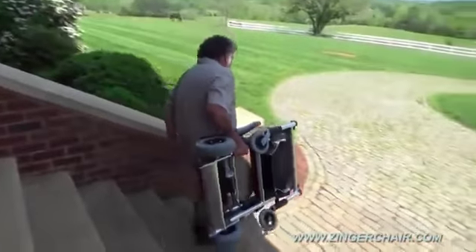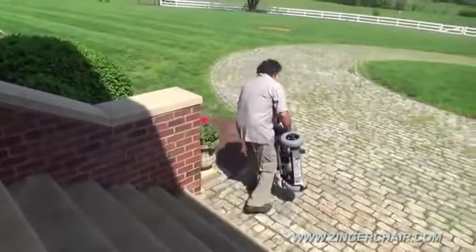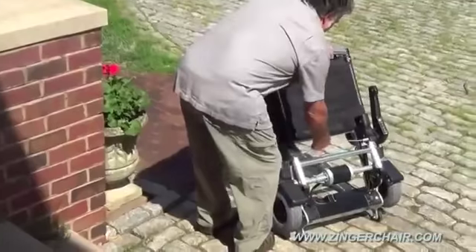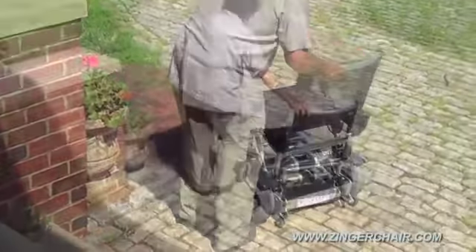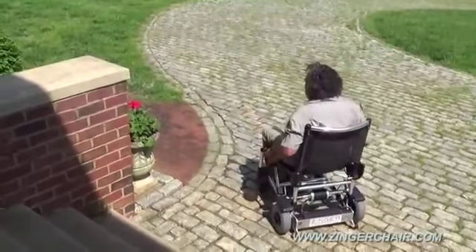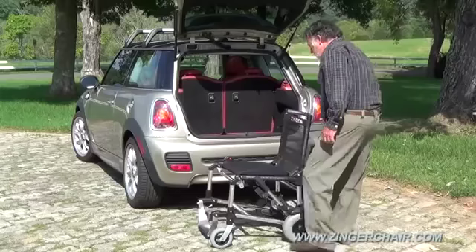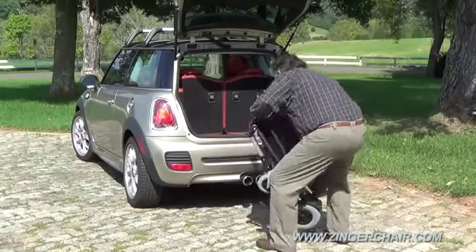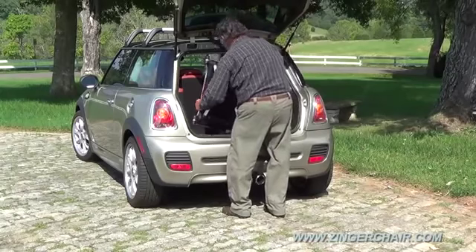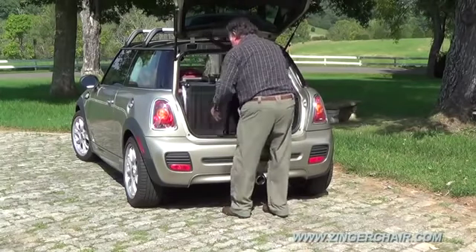Folded, it's so compact that it can actually be carried down the steps like a suitcase. To unlatch it, just pull the release cable and the Zinger opens as quickly and easily as a lawn chair. Nothing is as portable. With a folded height of just 10 inches, the Zinger actually fits into this Mini Cooper with its back seats up.